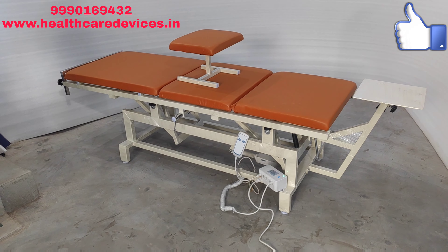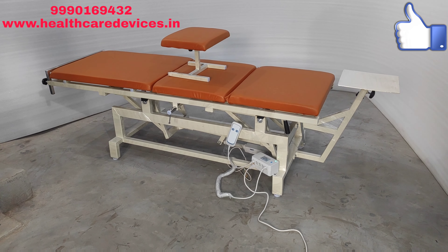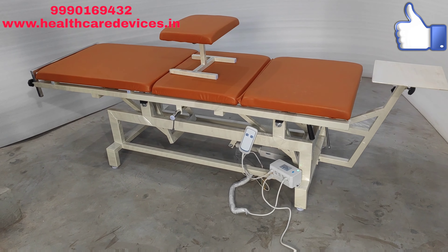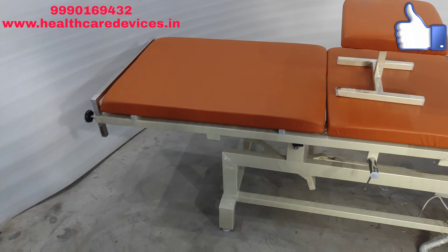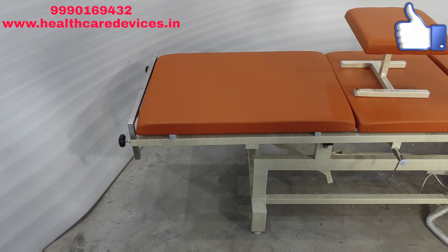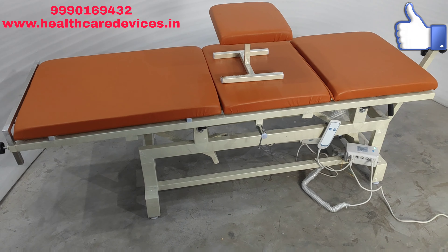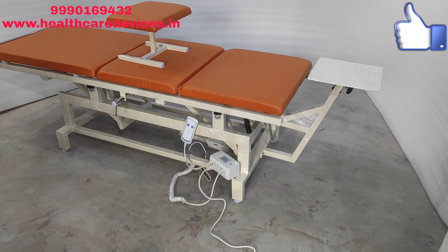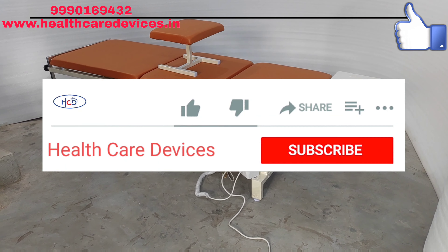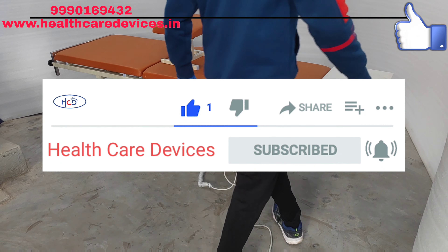So as you can see, you get a 3-fold bed with high-low bed. It will be found in this way — like the 3-fold bed, it is the same. The high-low is attached. I am going to show you how the high-low bed will be done.